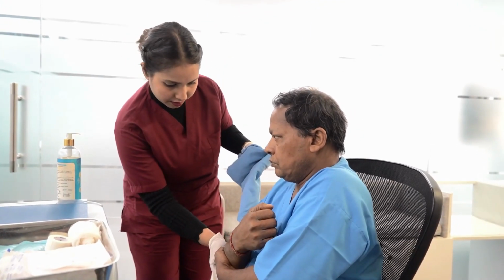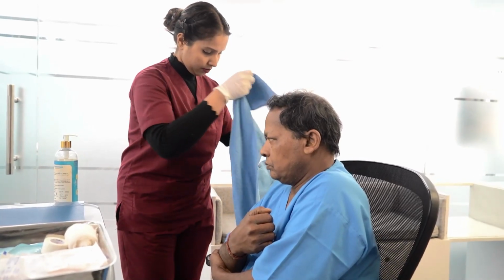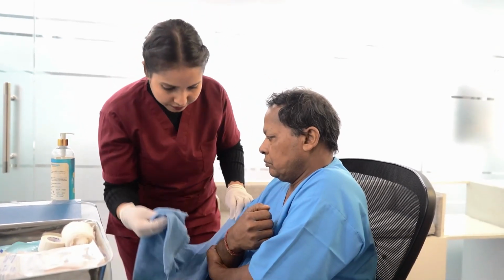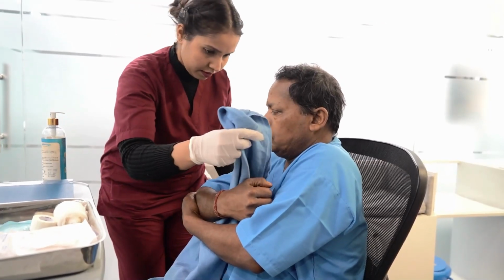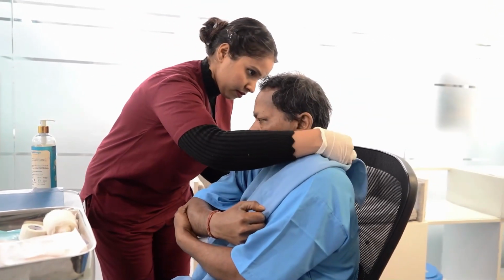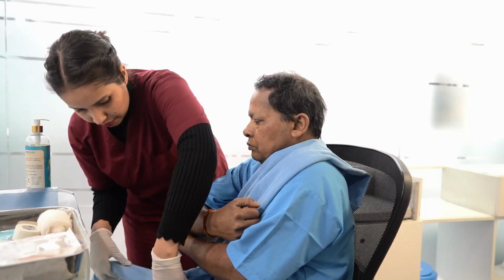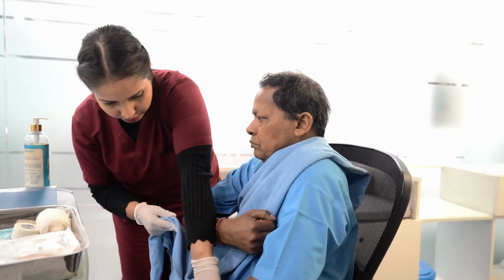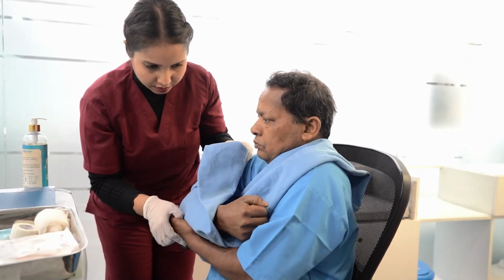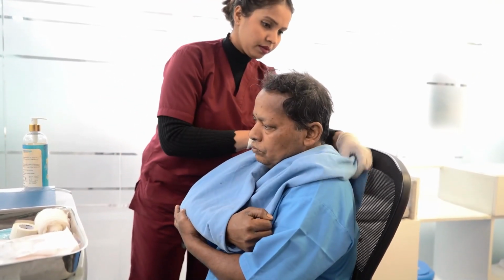Gently slide the triangular bandage underneath the arm. The point of the triangle should be underneath the elbow of the injured arm. Bring the top end of the bandage around the back of the neck. Fold the lower end of the bandage up over the forearm to meet the top of the bandage at the shoulder of the injured side.